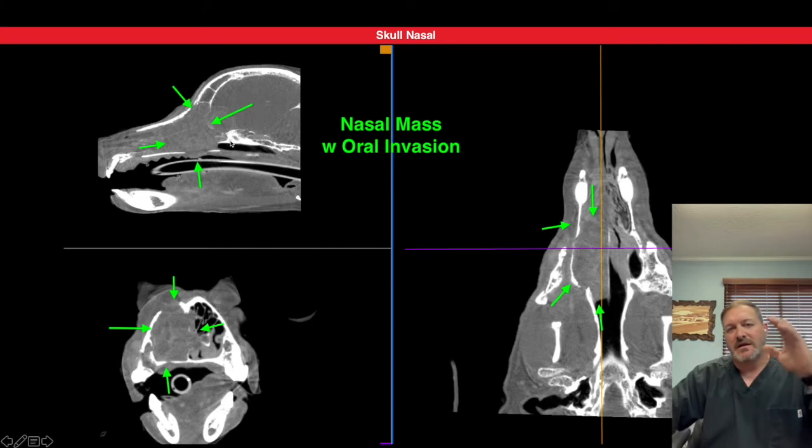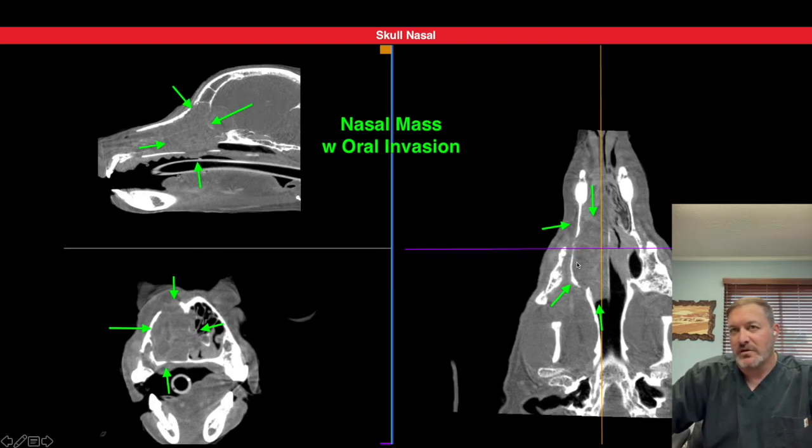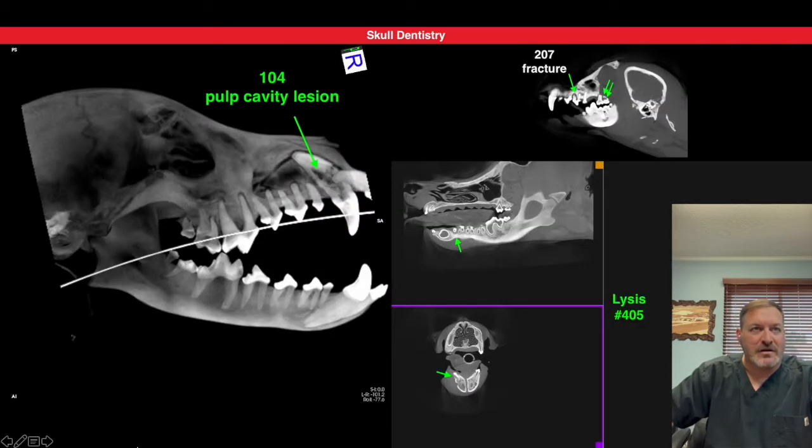We can see this in what we call the multiplanar view. So we have a sagittal view here in the top left. We have what we call an axial view. This is our traditional CT view that we would see with slice CTs. And then over here we have our coronal view, or you can call it a ventral or dorsal view, but we call it a coronal view in cross-sectional imaging. So we have 3 dimensions on the screen in front of us, or we can actually render it into a 3-dimensional model on the screen, like what we saw back here in dentistry with this skull.